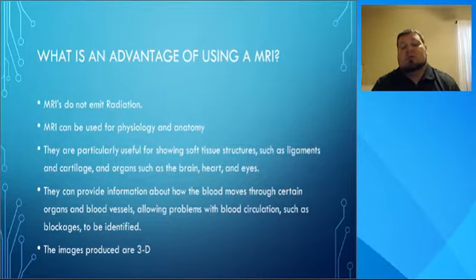And what is also neat about that, say you scan your brain and you want to see all the arteries that are moving through your brain, you can isolate those and you can see them in 3D. So the doctor can literally turn the image any way he wants and look at it from any angle, because when you scan, it's a 3D scan.